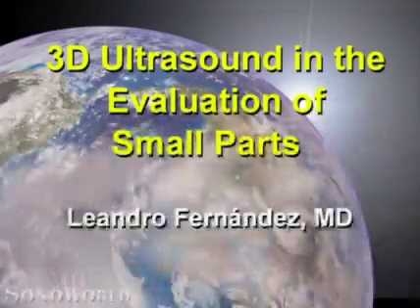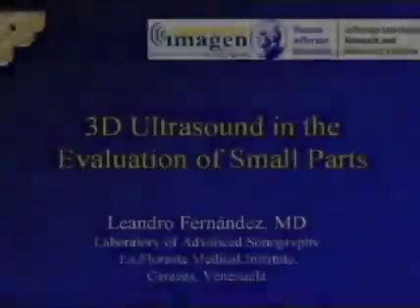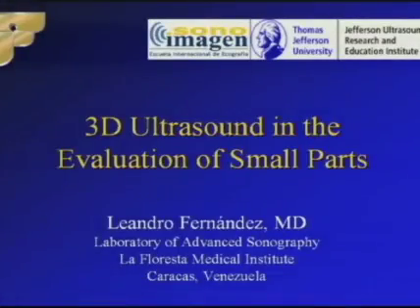I'm Dr. Leandro Fernandez, Director of the Laboratory of Advanced Sonography at Instituto Médico La Floresta in Caracas, Venezuela. And I will present the topic, three-dimensional ultrasound in small parts. Three-D ultrasound in the evaluation of small parts.